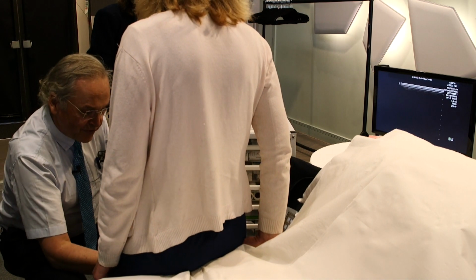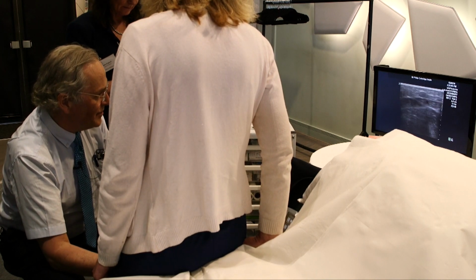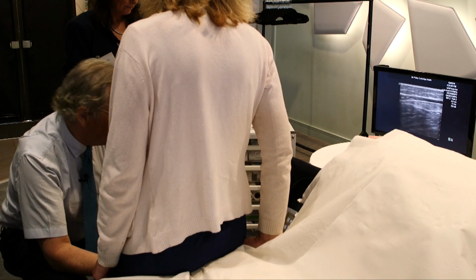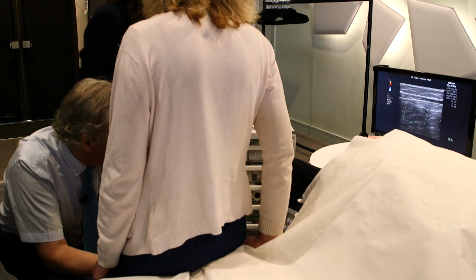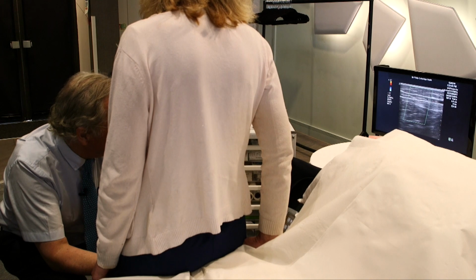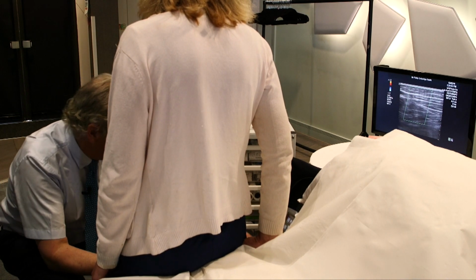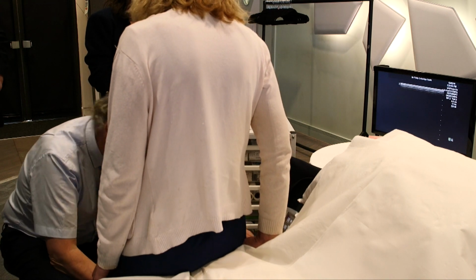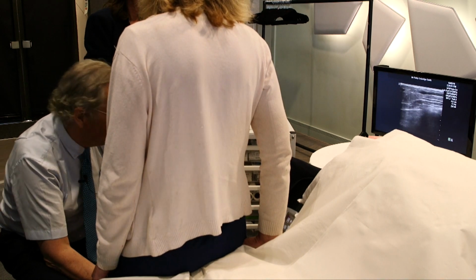There is some venous reflux in the great saphenous vein, or there was last time I looked at it. And so my plan is to treat this as well. Oh, it disappeared under your trolley. Well, there is not a lot of venous reflux in it at the moment, but last time we looked at it, there was some. And you've got thread veins in relation to it down here, which I expect you'll want me to disappear as well.